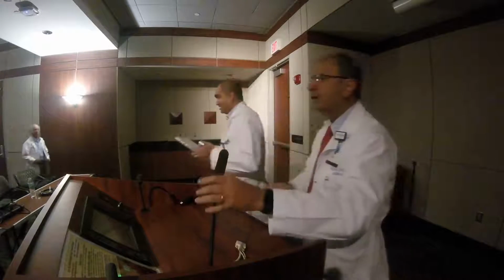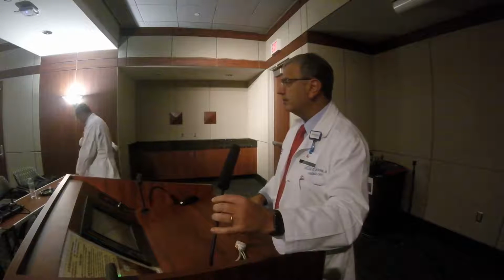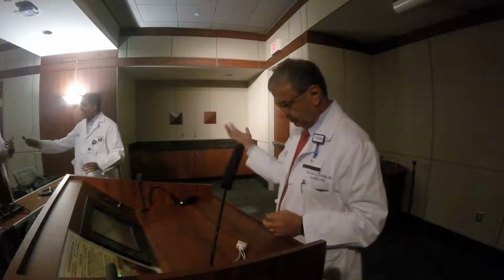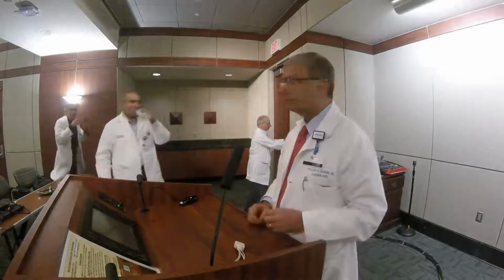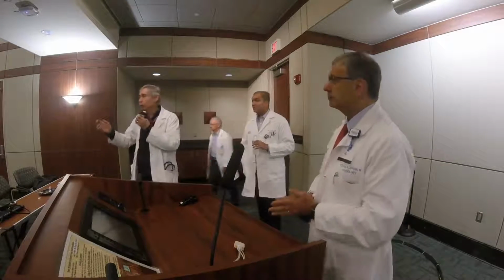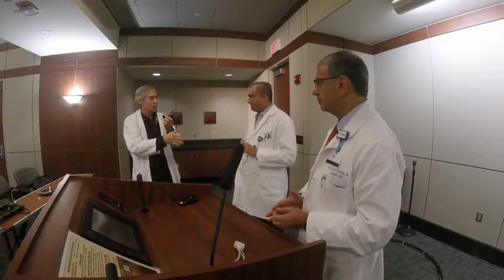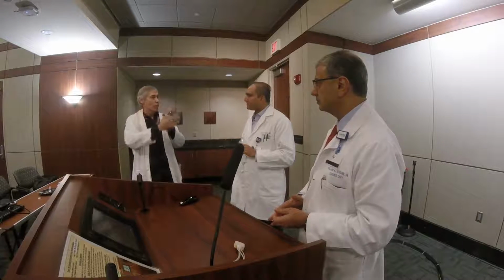Questions? Yeah, so I have one question for Dipan. Can you come here? Because I think the correlations between CMR and nuclear are very interesting. Again, there's this issue of a gradient, right? Where you look at 0% hyperenhancement versus 100% hyperenhancement, and where you look at zero counts in the myocardium versus 100% of normal count activity in the myocardium. And somewhere around 50% is where you see viability, really a greater likelihood of seeing improvement versus not.